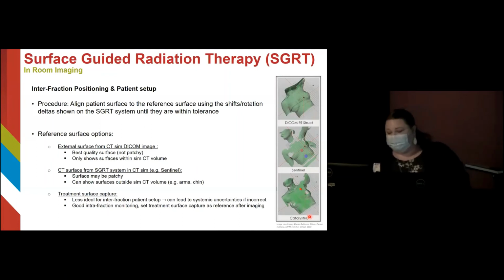And then lastly is the surface captured in the treatment room. This is less ideal for monitoring interfraction setup because if it's incorrect, it could lead to systematic uncertainties. However, if this surface is captured after imaging, it's a good reference to monitor intrafraction motion.